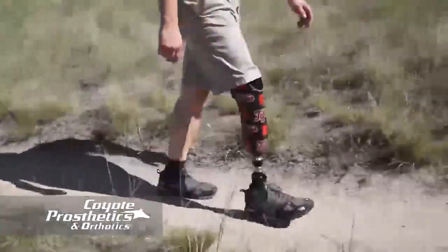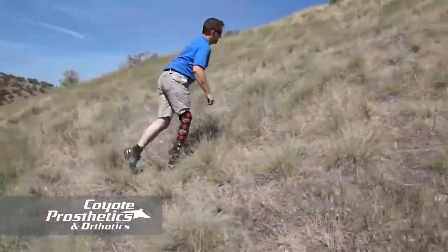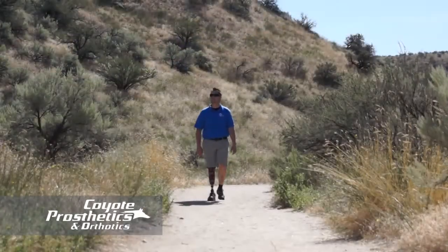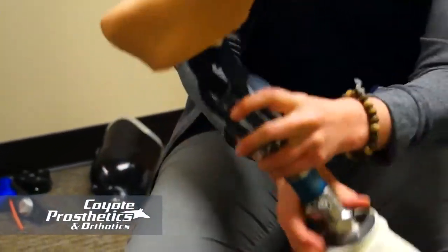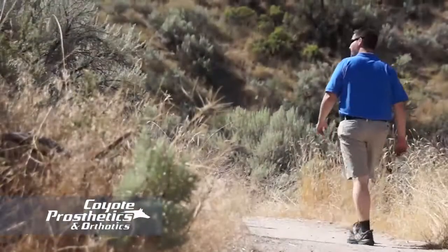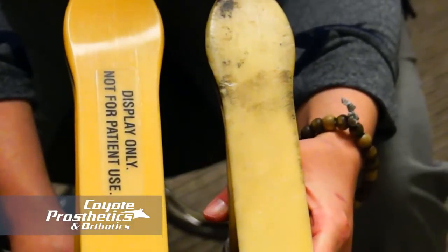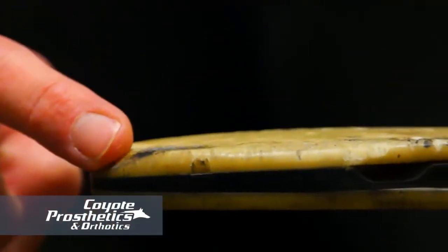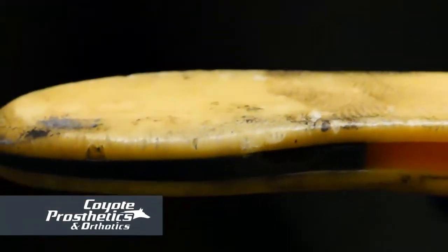Sometimes in that foot shell, you can get sand, dirt, things like that, just depending on where you are and what your activity level is. If you have any issues with that, sometimes you can just turn the leg over and kind of tap it out. But if you need a more thorough cleaning, definitely bring it into your prosthetist. They can take the foot shell off, take the foot apart, and clean whatever needs to be cleaned. If you get sand into your foot shell and it's in there for a long period of time, that can act like a sandpaper and actually wear down your prosthetic foot faster, that inside part. So you want to be careful about that.